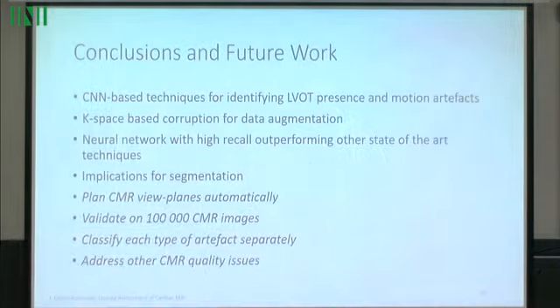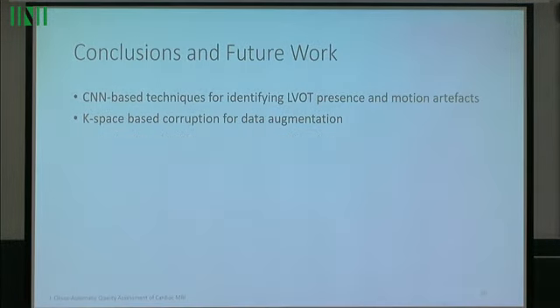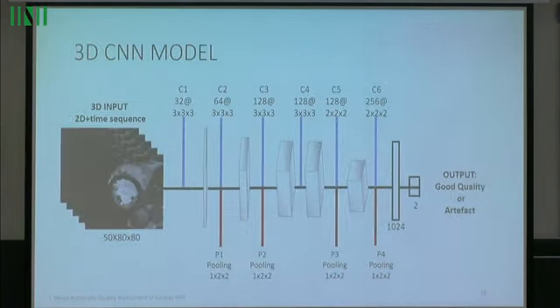So for the training and the test data, do you have the same imbalance? In the second problem you are mentioning, because in the first problem we didn't have the imbalance. So basically, this is a tenfold cross-validation setup. During training only we add additional augmented images in order to balance the classes.